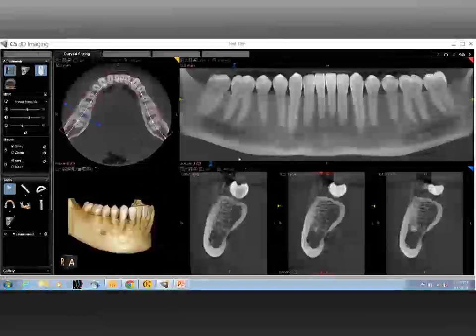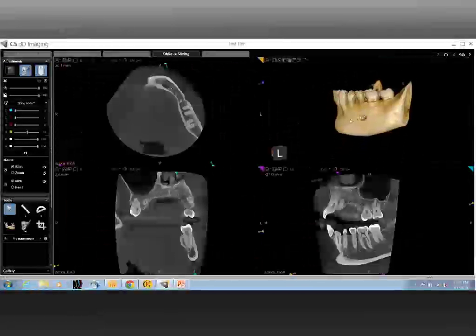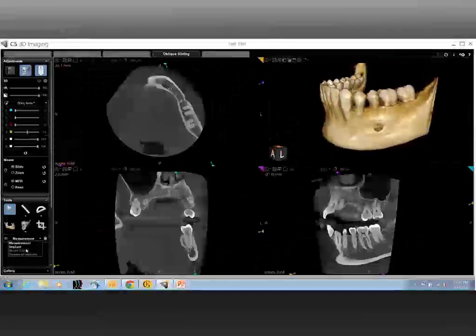That's a good question. So as an extension to the previous answer, once all those things are evaluated, maybe the angulation of the ridge, the lingual undercut, and the morphology of the ridge have nothing to do with endodontics, but the inferior nerve and the foramen do have a critical role to play. Now, specifically to endodontics, canals.